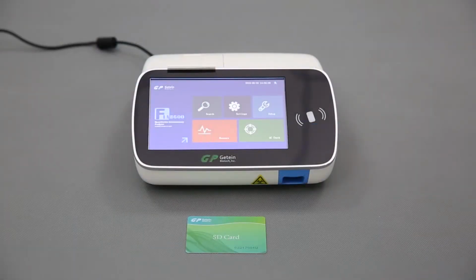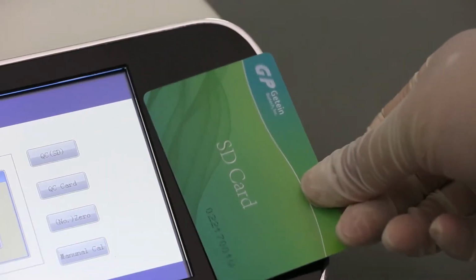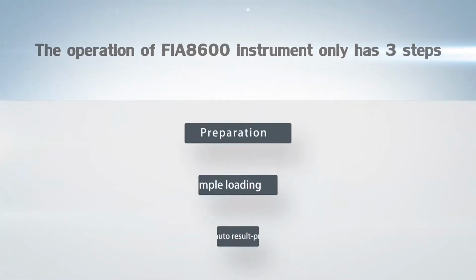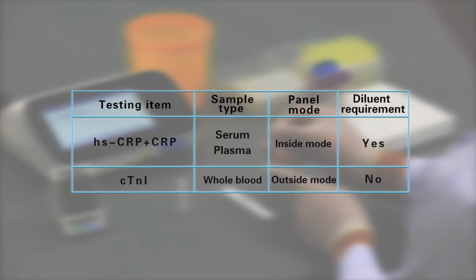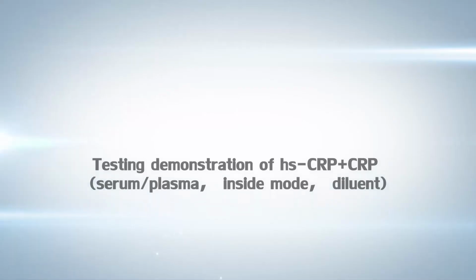The operation steps are illustrated as follows. Click QC Check on the main interface, then click QC SD, and put the QC SD card properly. Data will be read automatically. Then click OK to complete the QC process. The operation of the FIA8600 instrument only has 3 steps, which are very simple. The testing process could generally be categorized into 2 types, according to diluent requirement. The tests of HSCRP and CTNI are used here as demonstrations.